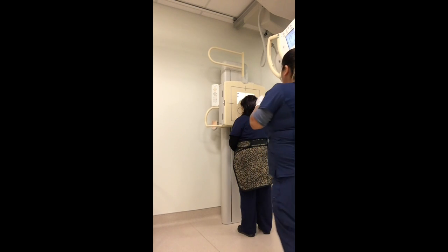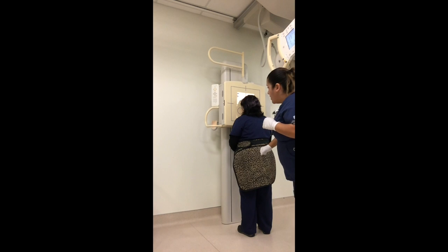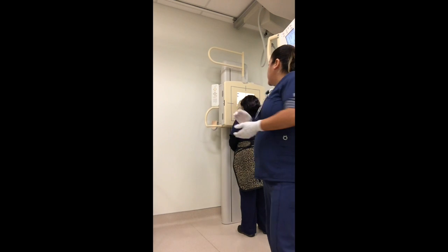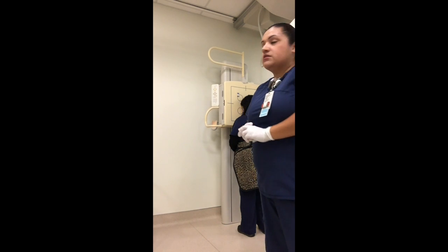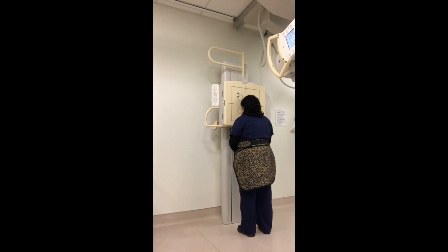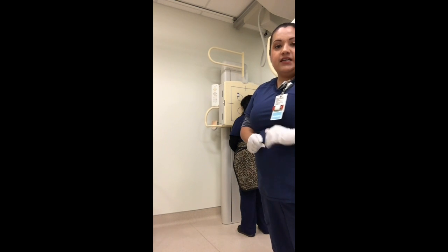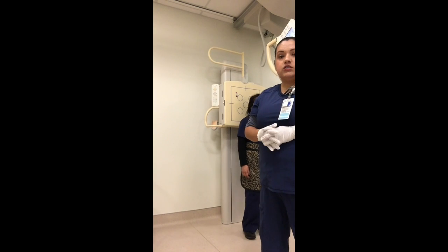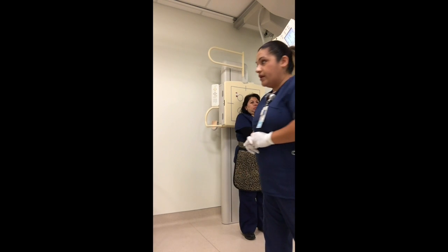I have my left marker on my patient's left side. And my cassette is 10 by 12 lengthwise. And the technique I'm going to use is about 85 kV at 14 mAs. So Miss Rodriguez, go ahead and hold your breath. Beep. And on to the next projection. And again, this was at 40 SID.